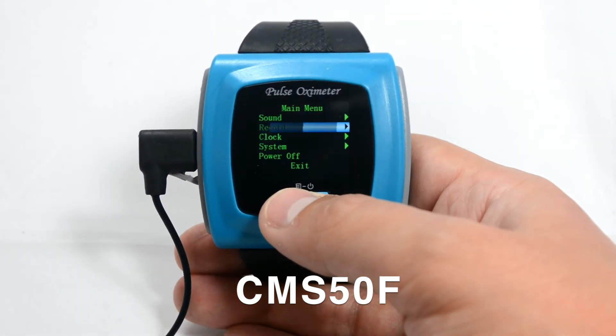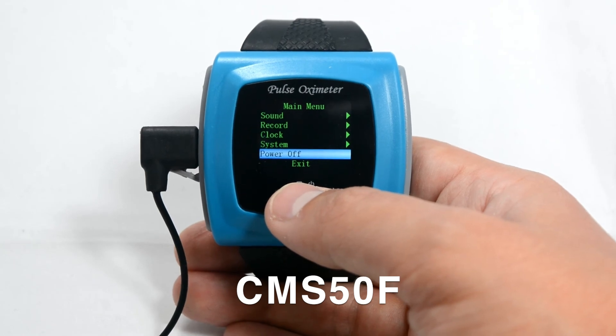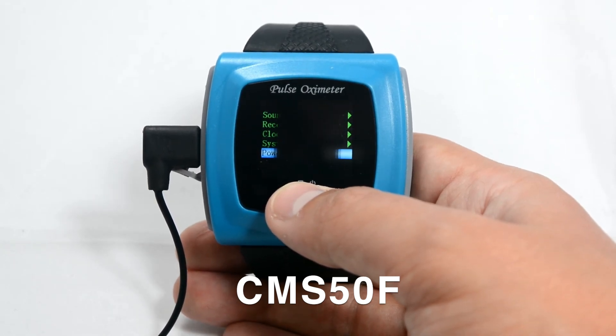To power the device off, scroll down to power off, make sure your finger is not inserted, then press and hold.